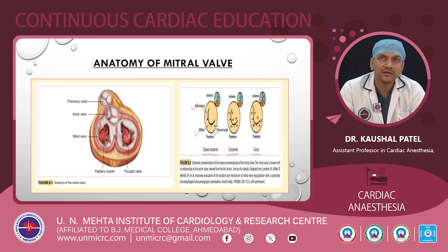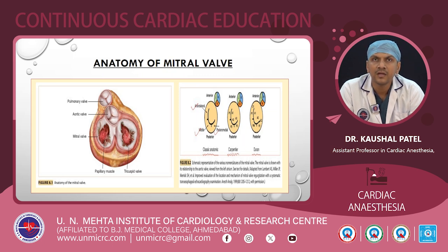So, the anterior mitral valve leaflet and the posterior mitral valve leaflet. The anterior mitral valve leaflet covers 2/3 of the mitral valve area and 1/3 of the mitral annulus, and the posterior mitral leaflet covers 1/3 of the mitral valve area and 2/3 of the mitral annulus.